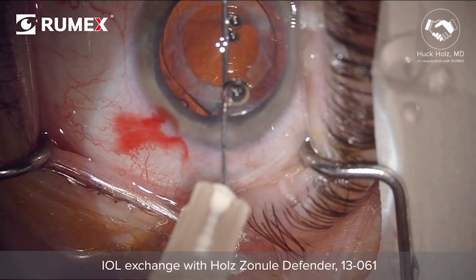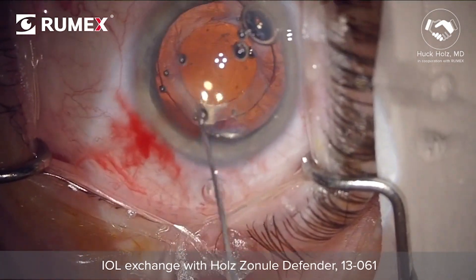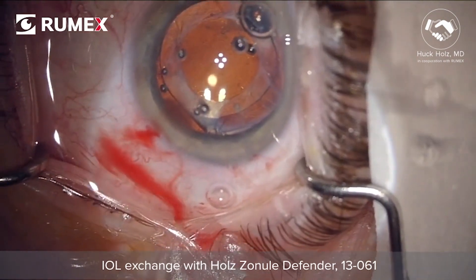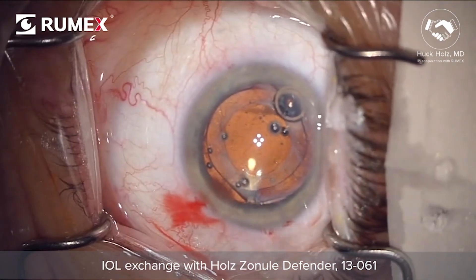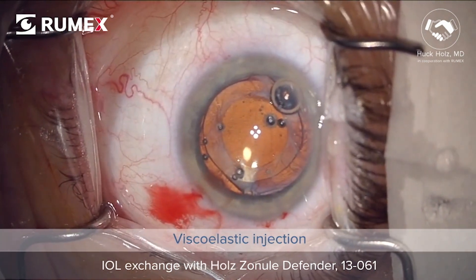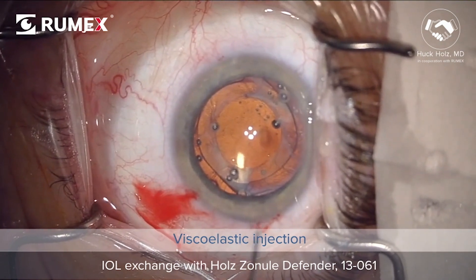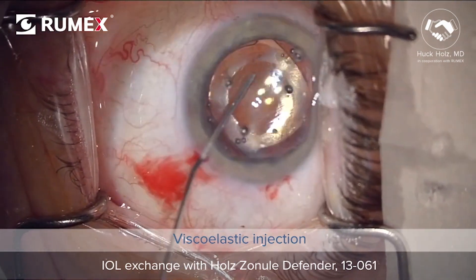The round end of the haptic. First, a 30-gauge needle is used along the haptic to infuse viscoelastic under the capsule rim. Viscoelastic is then infused around the optic through several paracenteses to free the lens further from the capsule bag.